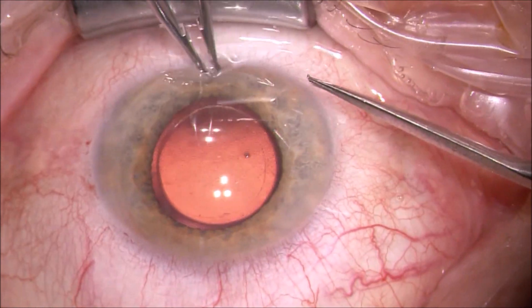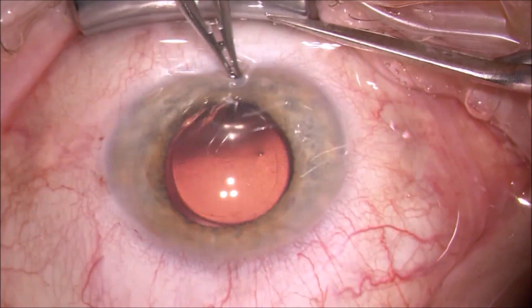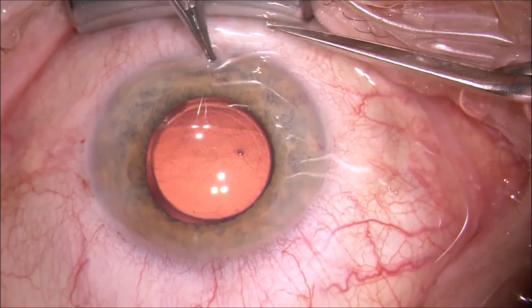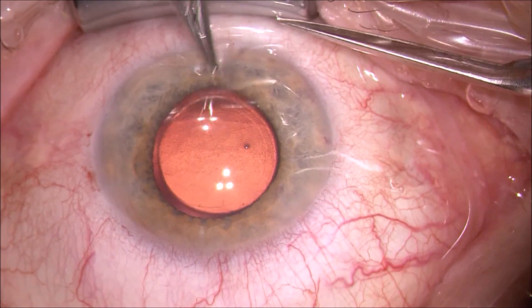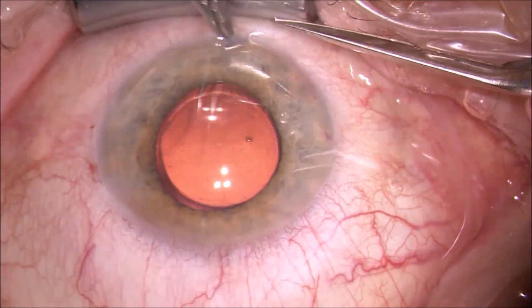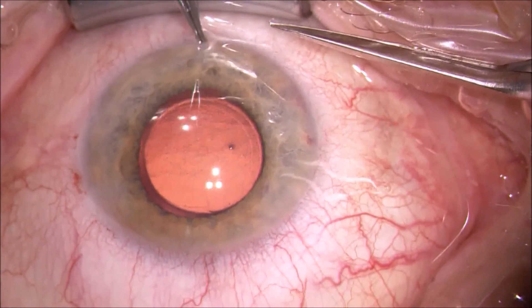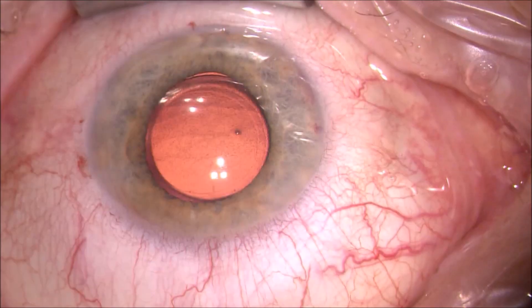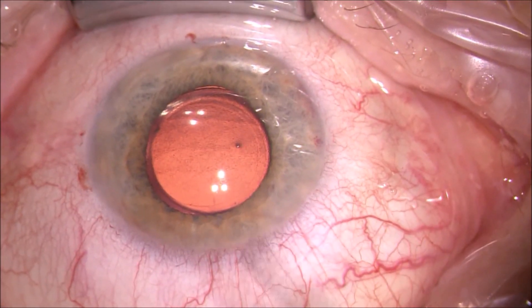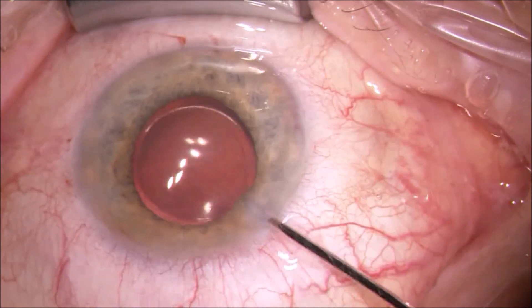This might destabilize the anterior chamber, and sometimes you really get huge iridectomies if you perform them manually. Now, why do I still use an iridotomy or iridectomy? I'm very afraid of the inverse pupillary block that can be caused by the endotamponade, either gas or air. I know there are surgeons in the literature who are not doing it anymore and don't seem to have problems, but in an outpatient setting I always prefer this as an extra measure of security.